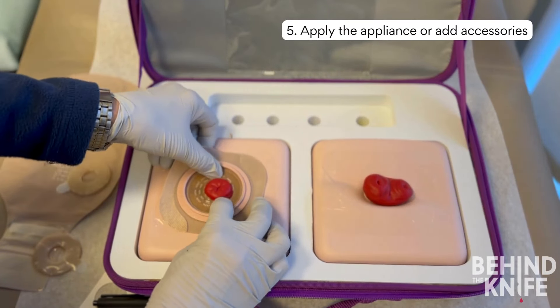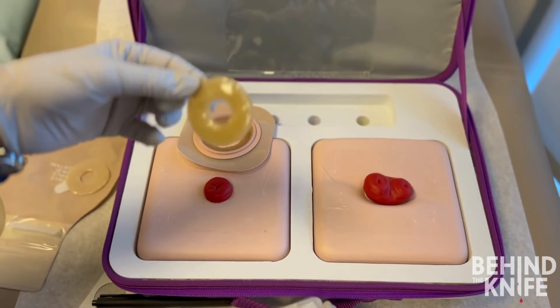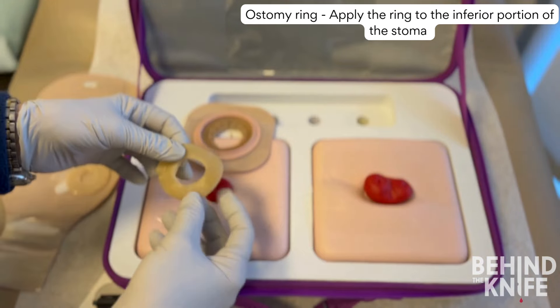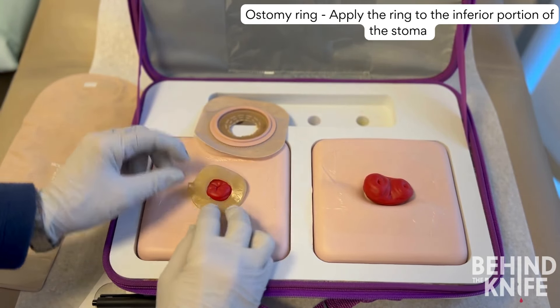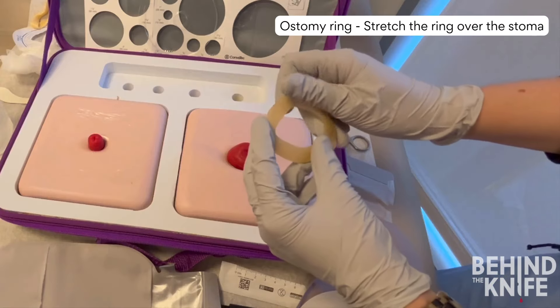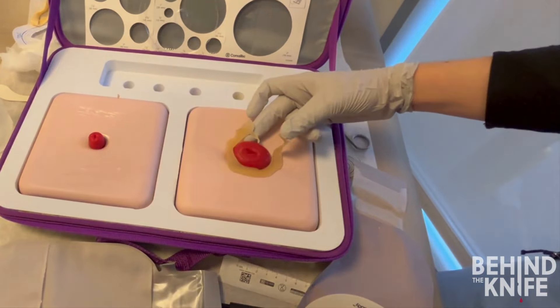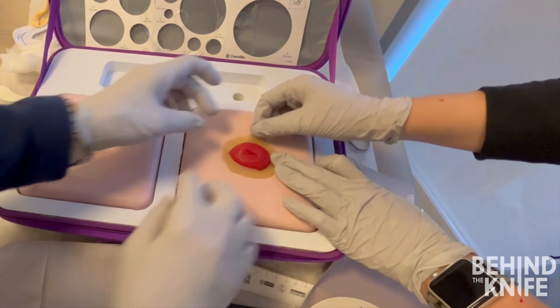After the appliance is cut, you can either apply it directly or use accessories to help prevent leaks. First up is the ostomy ring. Start by stretching your ostomy ring to the appropriate size, then apply it starting at the bottom of the ostomy. Since stool runs down into the bag, you want to start at the bottom to ensure a good seal and protect the skin. The ostomy ring should be touching the stoma with no visible skin. Hold the ring inferiorly and stretch it over the stoma so the ring touches the stoma circumferentially. If you see skin between the ring and stoma, you probably overstretched it — cut the ring at 12 o'clock, then align each side to abut the stoma and overlap at the top.